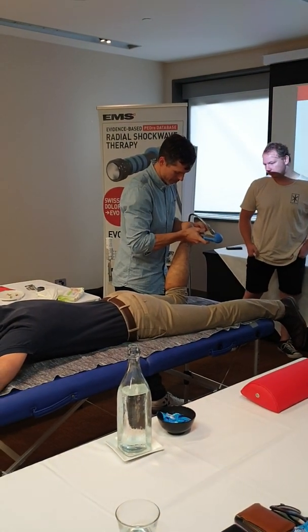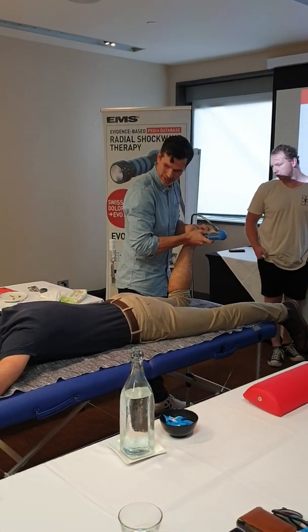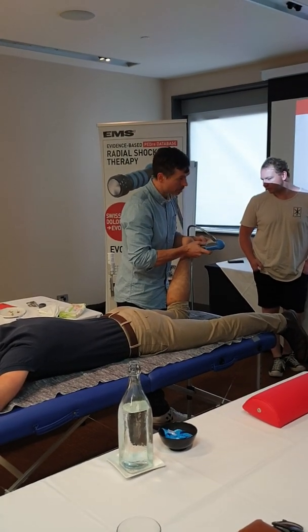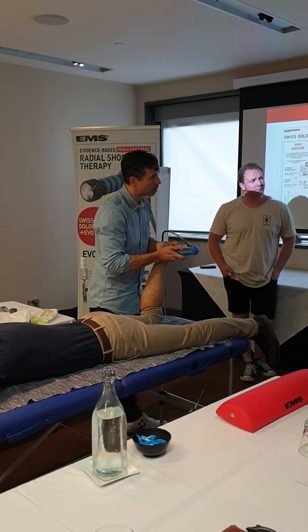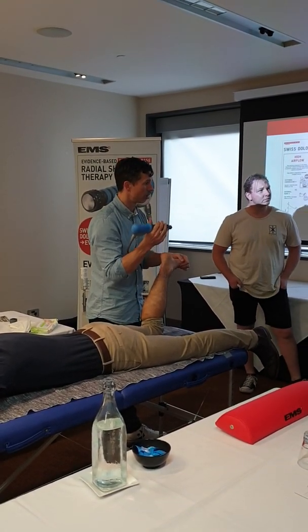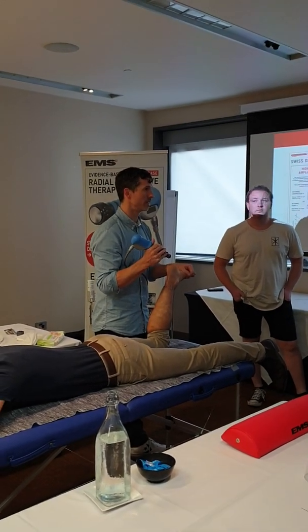I think you're right, actually. Feel later. Yeah, so that's what I'm saying. Is there anything with a handpiece you've got to be careful not to do with it? Just going to damage the handpiece? Damage the handpiece. Drop it on the ground, yep, repetitively, or stomp on it.